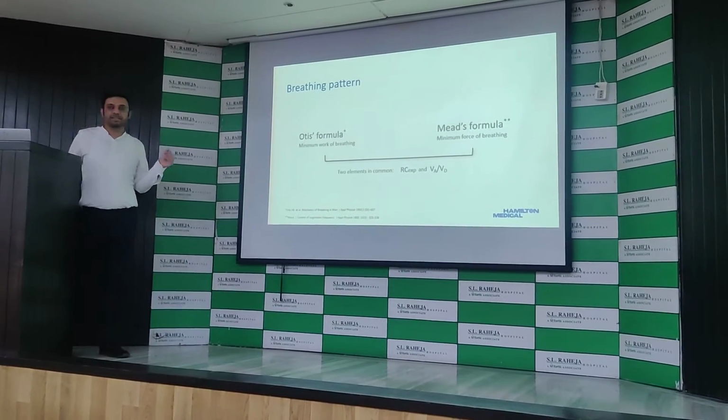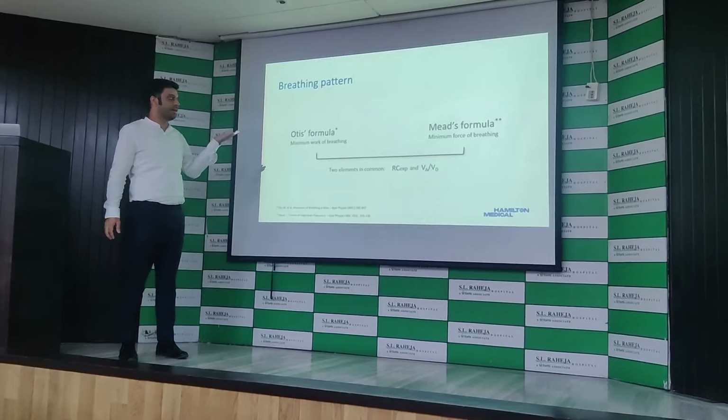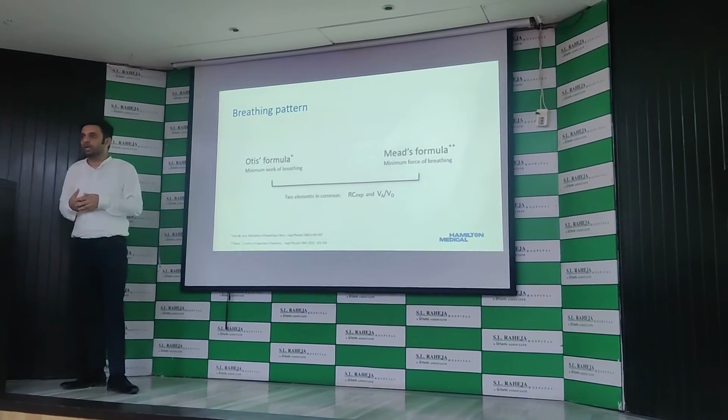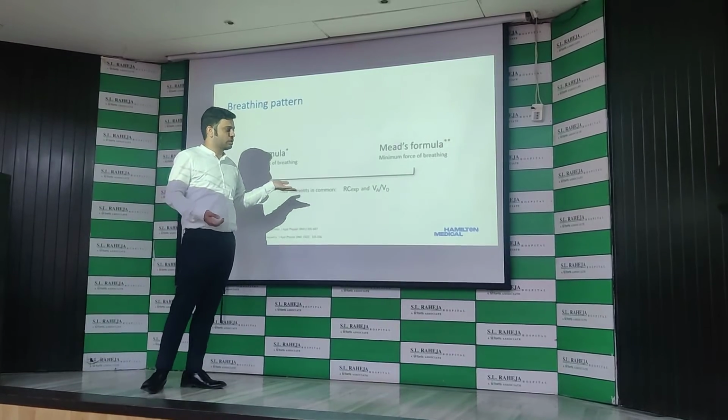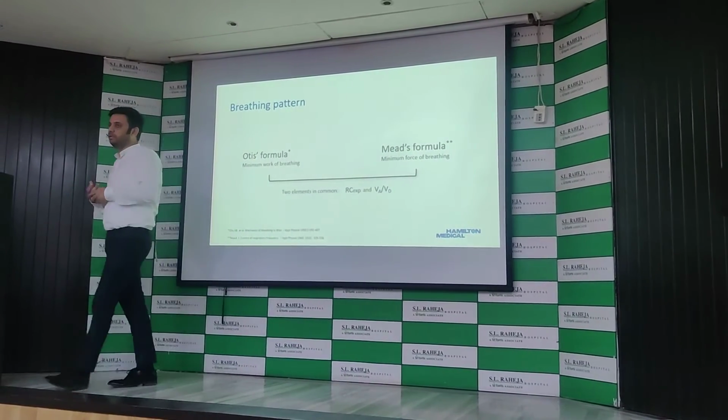So again, this is explained by her in terms of the Otis formula and the Mead's formula. So we have two elements in common, which are the time constants, and the alveolar ventilation and the dead space ventilation.